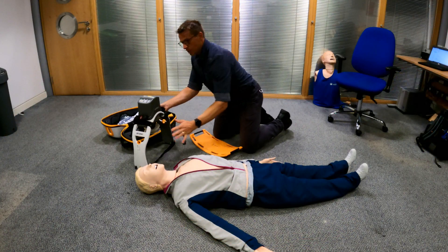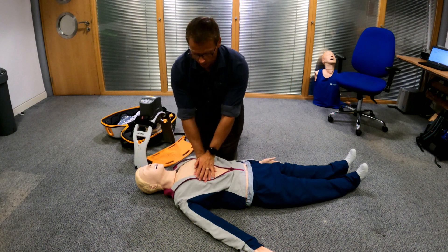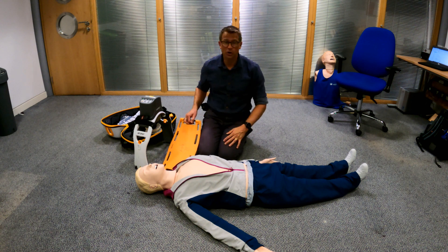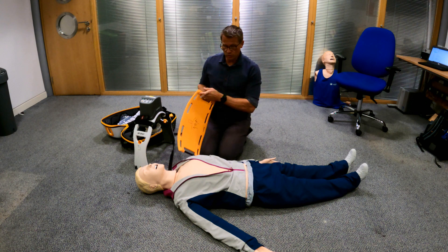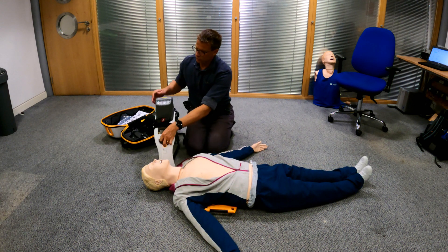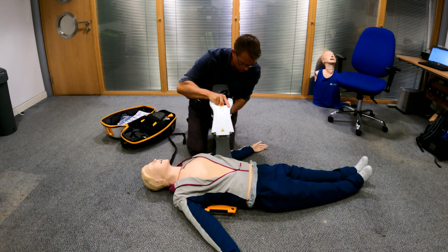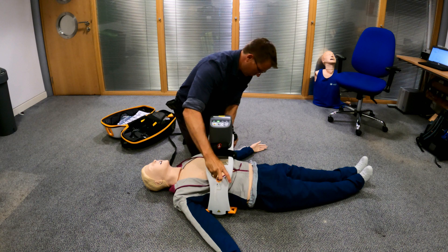When we get to the patient and they're in cardiac arrest, CPR will already be ongoing. What you have to do is coordinate putting this on whilst minimising the amount of time off the chest. Because I'm on my own I can't show you properly, but it'll give you the insight. The backboard goes underneath the patient and sits on their back. The main unit then goes on top — you turn it on in anticipation and click these two bits on either side.